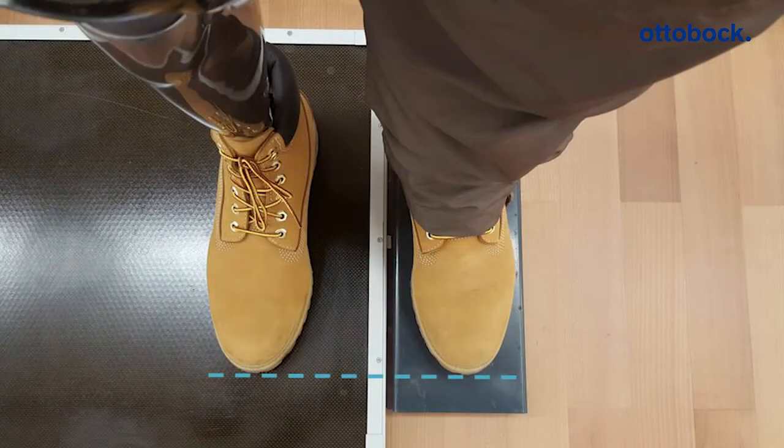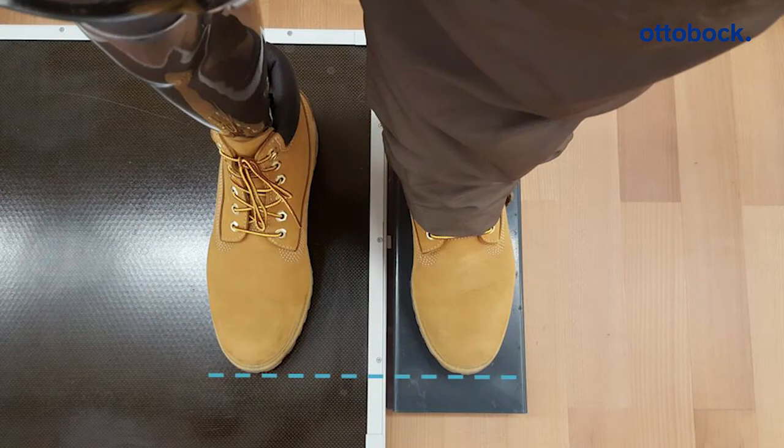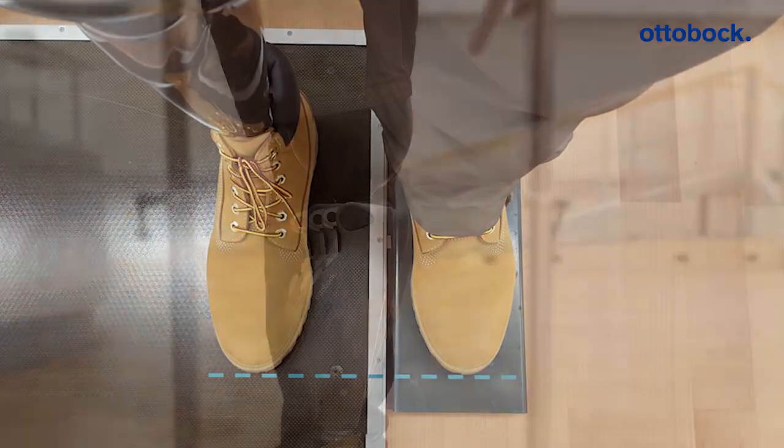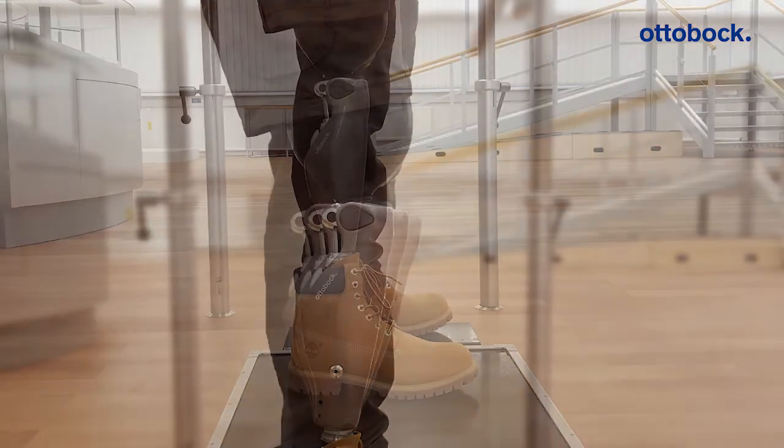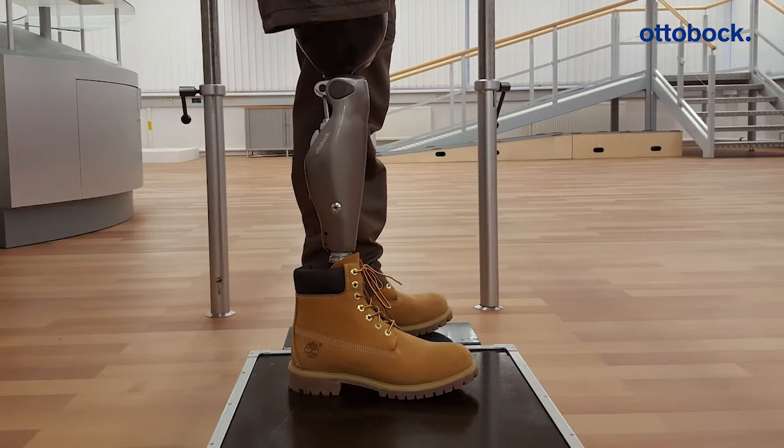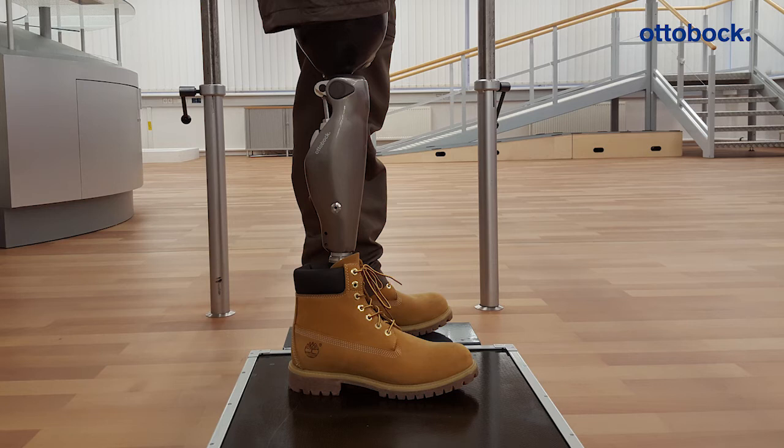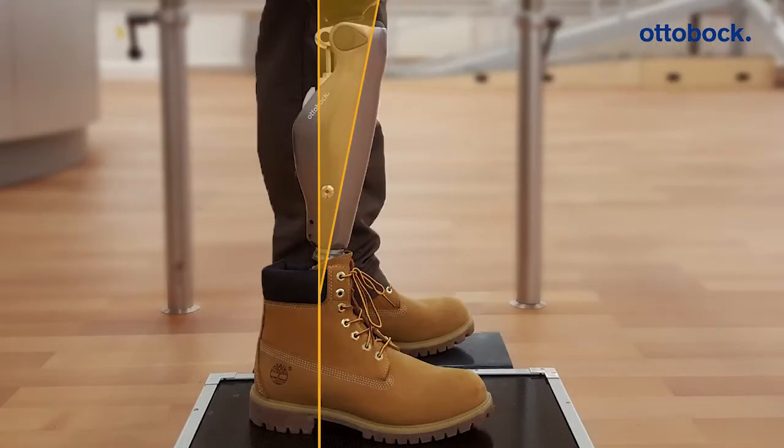The toes should be at the same height if the alignment is correct. Three criteria are required for a successful calibration: the user must stand still with the knee joint extended, and the angle of inclination of the knee joint must fall within the calibration range.